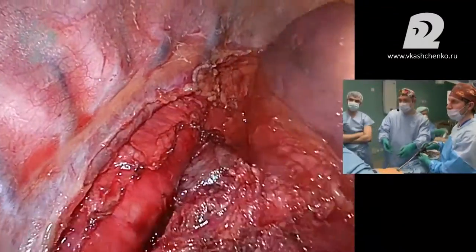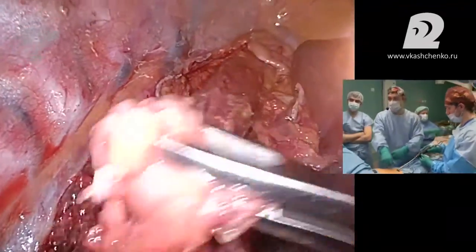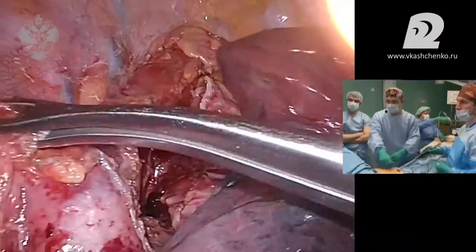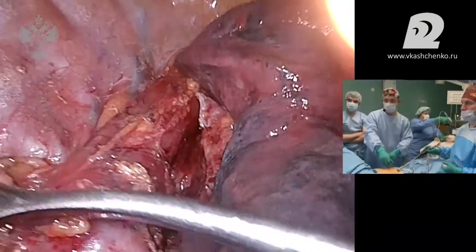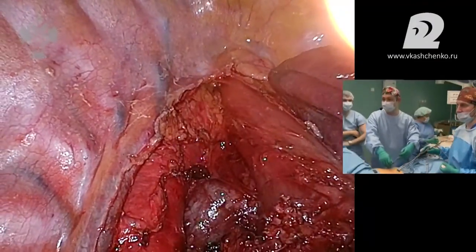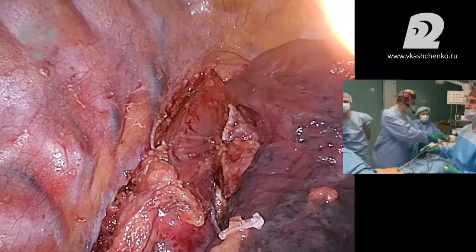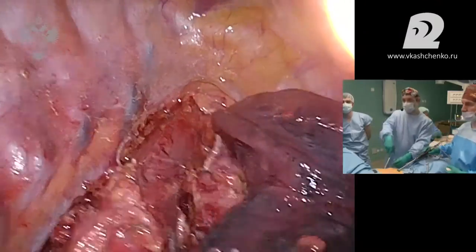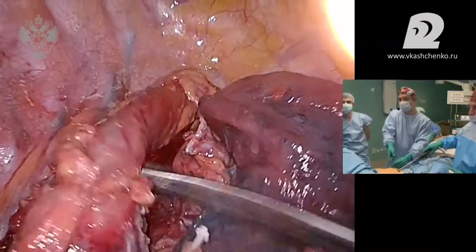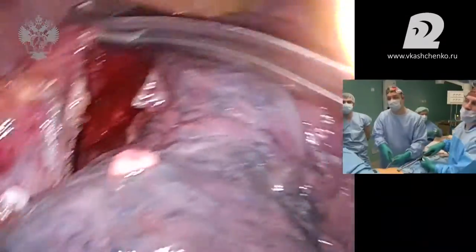Виктор Анатольевич, есть ли у нас трансляция звука в зал? Да, зал вас слышит. Виктор Анатольевич отошел. Но мы вас видим и слышим. Я буду стараться. Я понял, мне нужно думать, о чем я говорю. Ну, коллеги, тем, кто остался в зале, если таковые имеются, видно, что мы выделили пищевод полностью. Мы его обошли на всем протяжении. Вы видите, да? С обеих сторон.